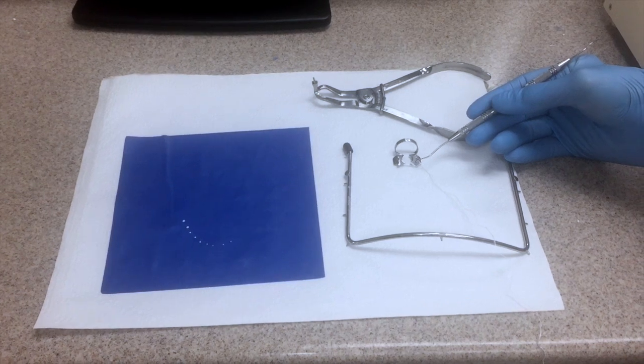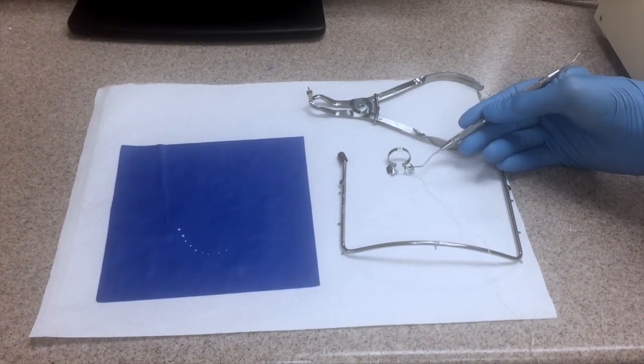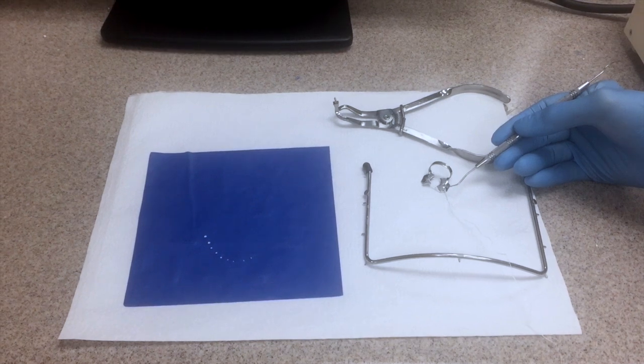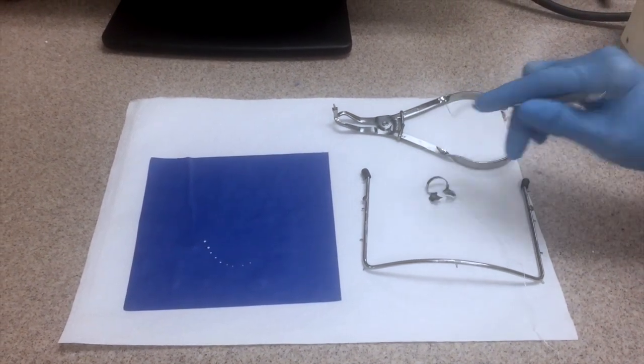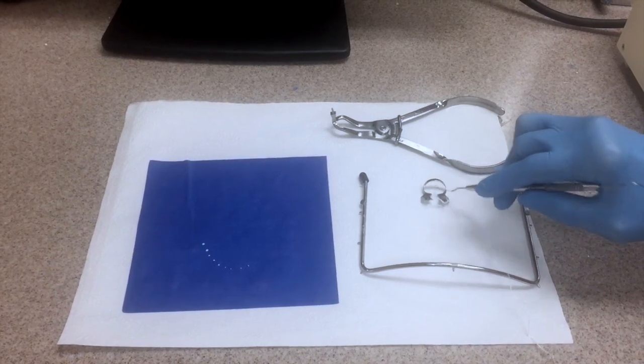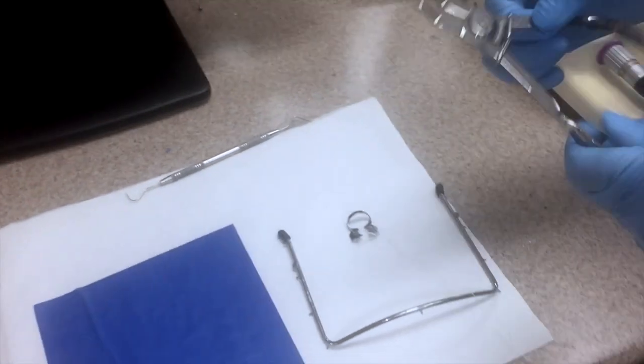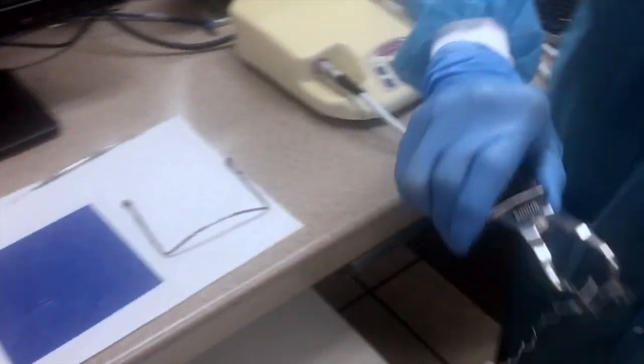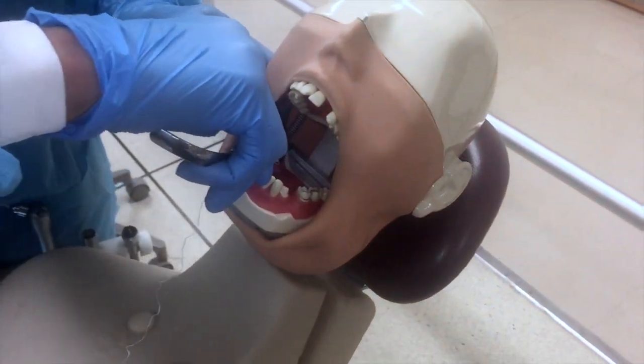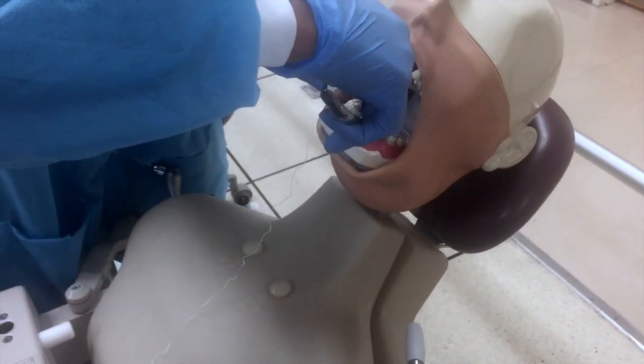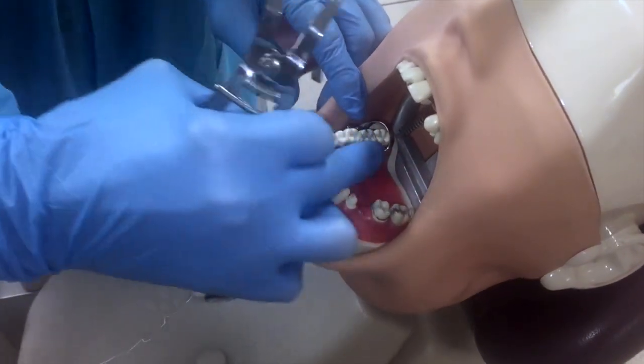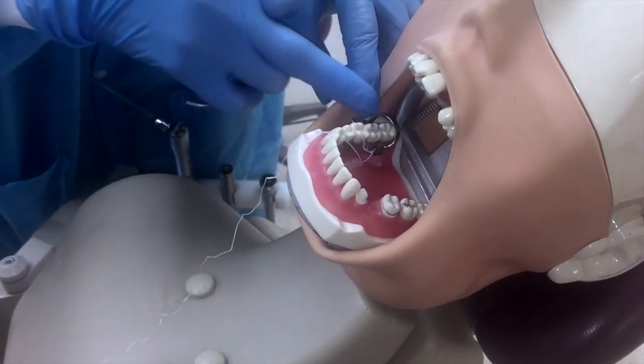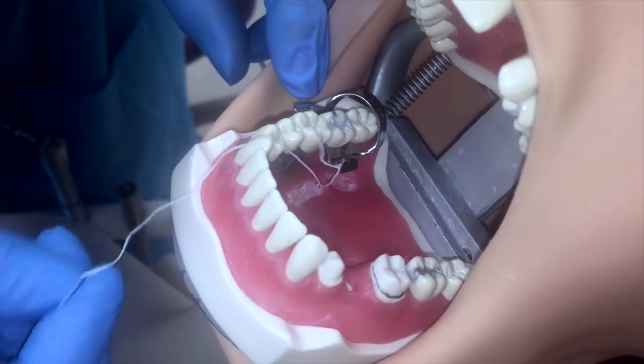Would you like to go over to our mannequin now? Each one of these clamps has a number in it. In your rubber dam cassette, the number of the clamp is printed in the box and it tells you which tooth this is good for. This is clamp number seven and it's great for lower molars. Let's get started. You want to make sure that this is going to fit our patient. We're going to put the prongs on the lingual and then roll toward the buccal. Let's test it. The bow always goes toward the posterior of the arch.